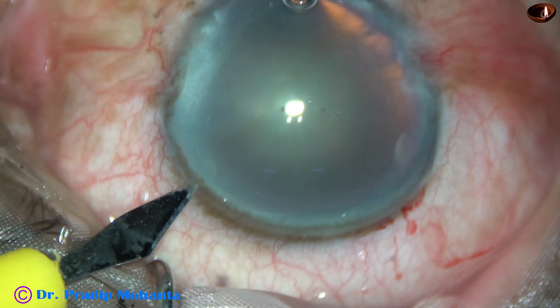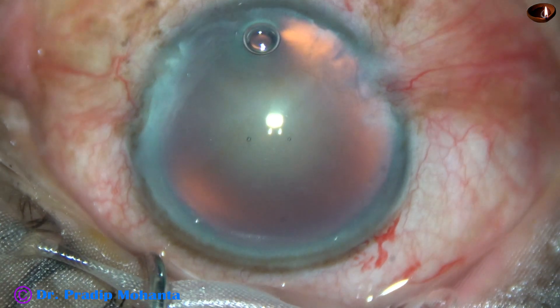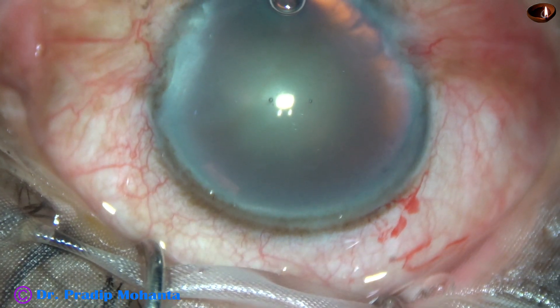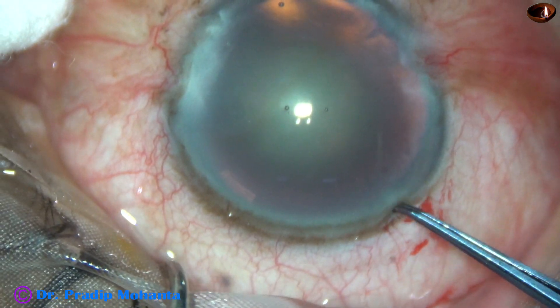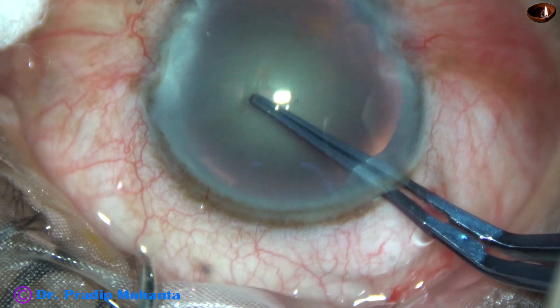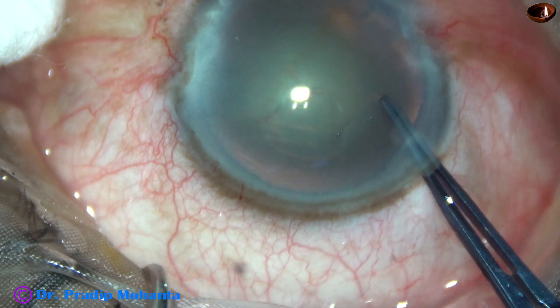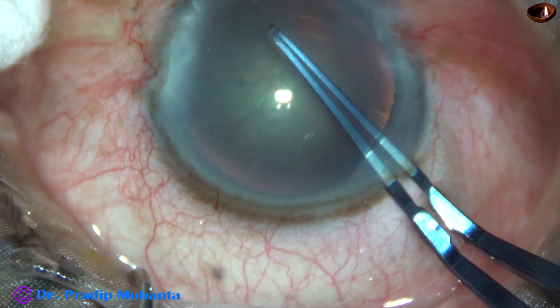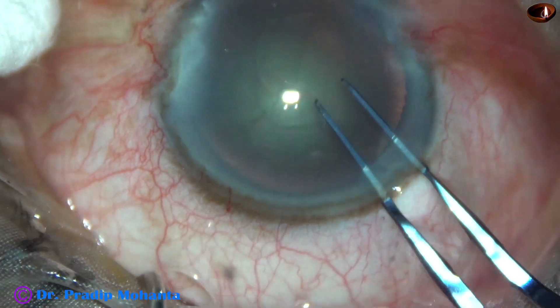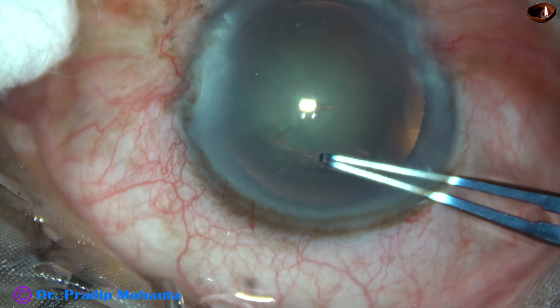The main incision has been made. This is a side port on the left side of the main incision. A Utrata forceps is taken and capsulorhexis is done. A capsular tag is raised and guided anticlockwise all around, and a round rhexis is achieved.